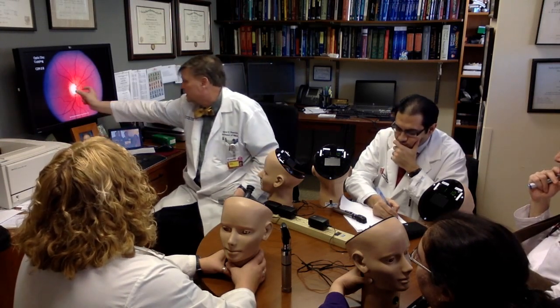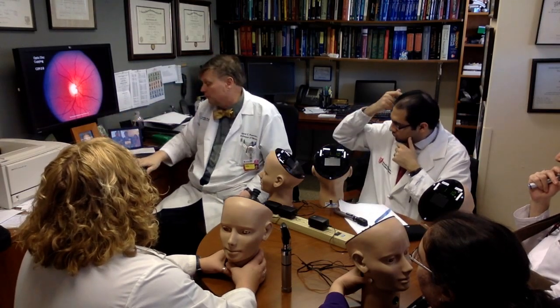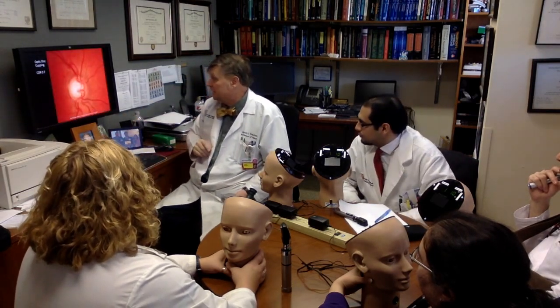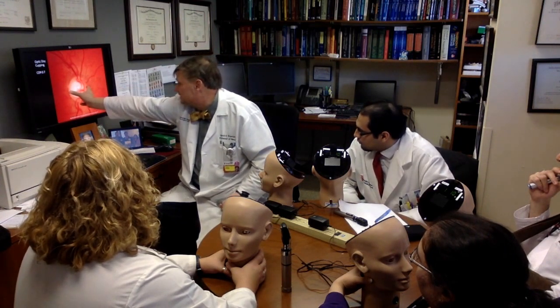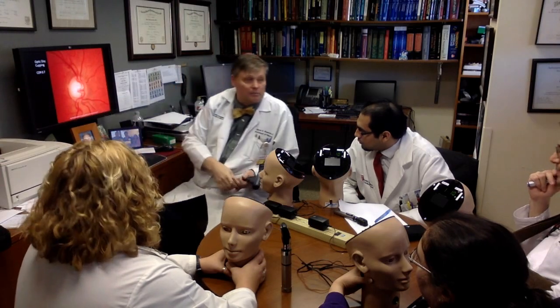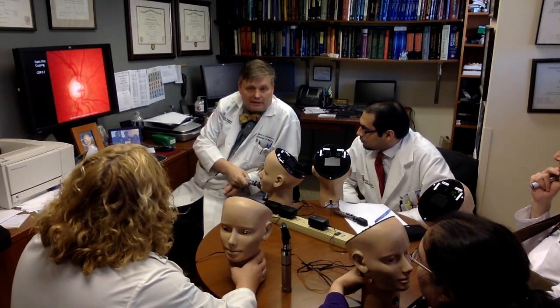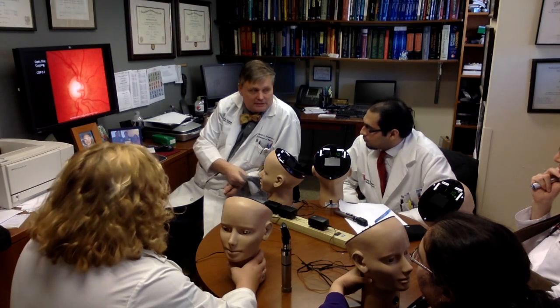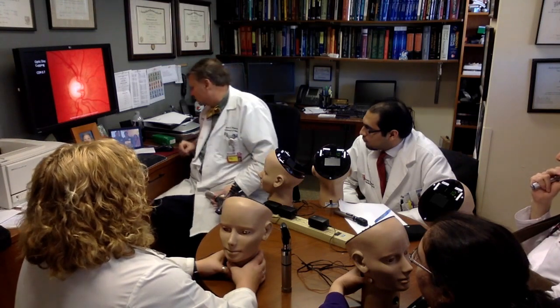So you'd say, oh my God, look at the cup here. It's this big compared to the disc here, really big. Now, look at this one, same story. Again, the disc is very sharp. Here's the size of the disc, but here's the size of the cup. So this is classically what you see in glaucoma. So even though we're not ophthalmologists, we want to be able to recognize at least markedly large cup to disc ratios. All right, very good.